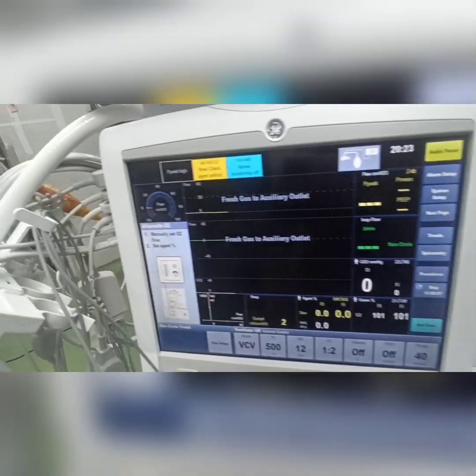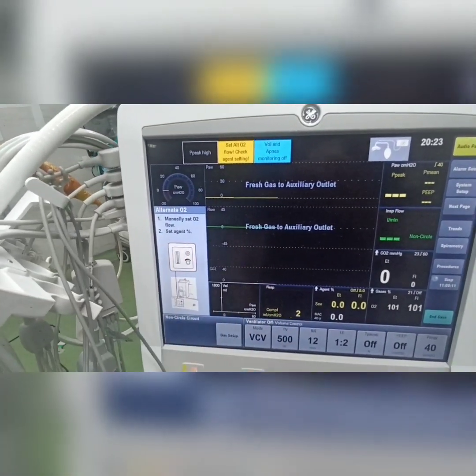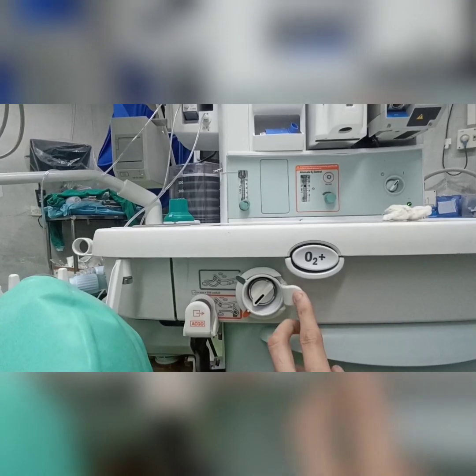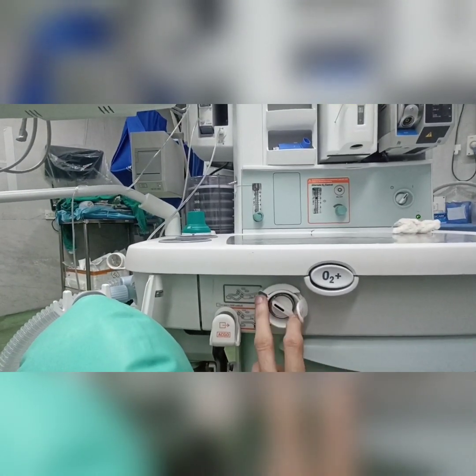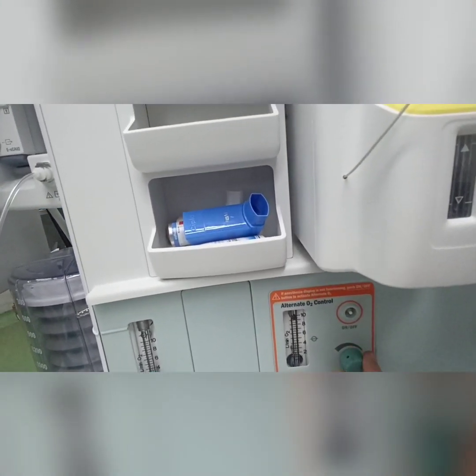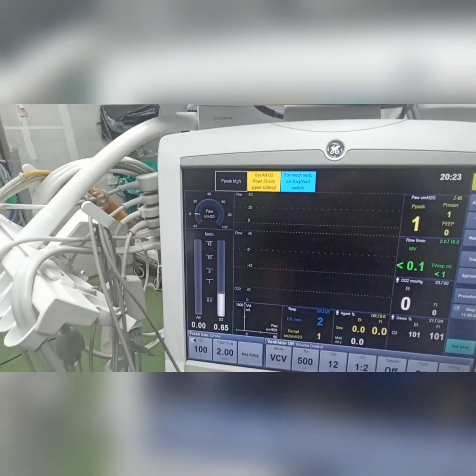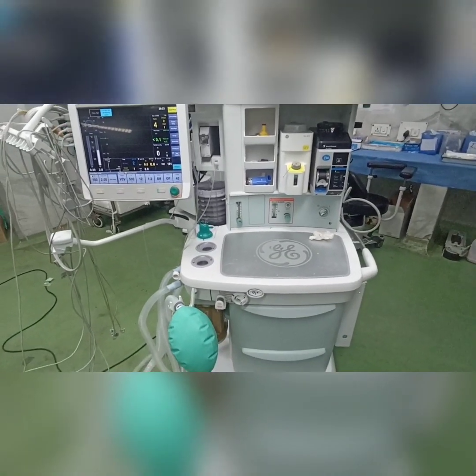Once we do that, this monitor will change to this. So this is a common gas outlet, which is the auxiliary common gas outlet, ACGO. Otherwise, normally for normal ventilation we'll be putting it on gray, and this is switched off with the value on 0, and then we can close it from here. So this was the alternate or auxiliary common gas outlet system for this machine.